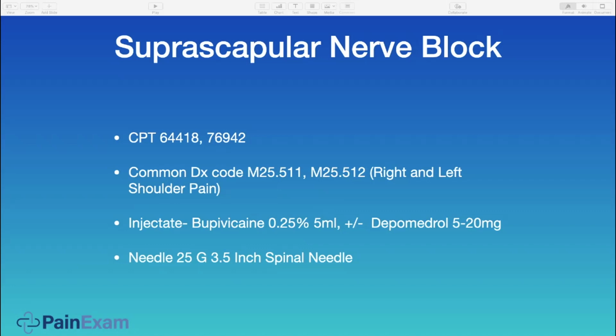So I have another question here. Do I ever incorporate the distal branch of the axillary nerve at the humeral head or the lateral pectoral nerve at the coracoid for the shoulder pain? Yes, I do. And I'm getting to the axillary nerve block right now.